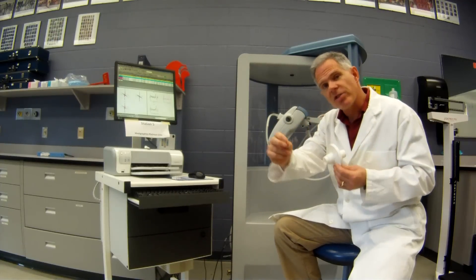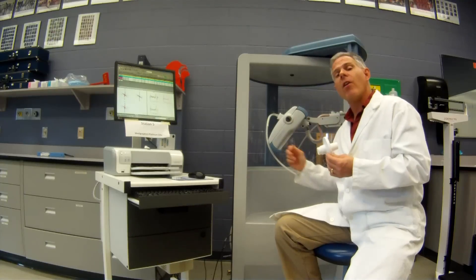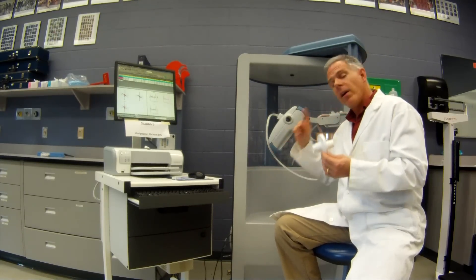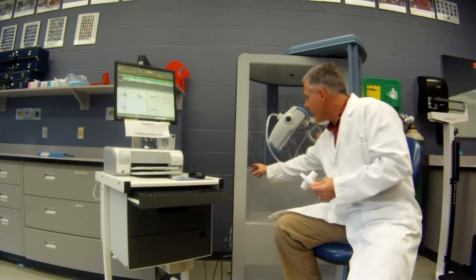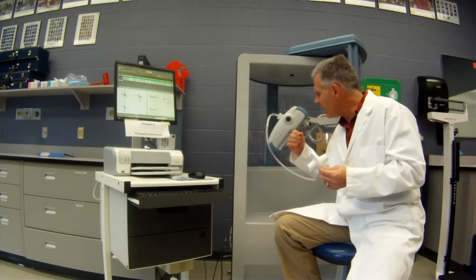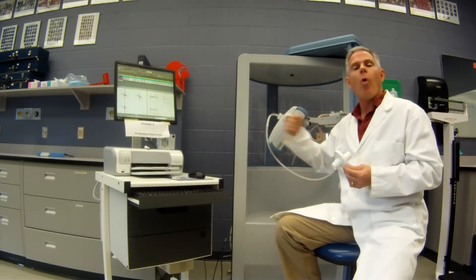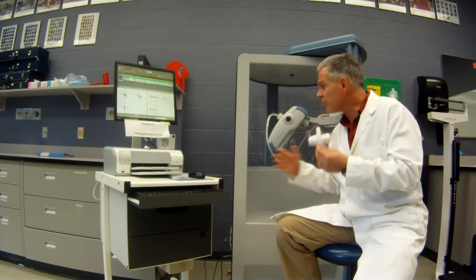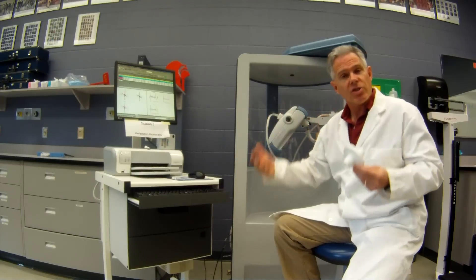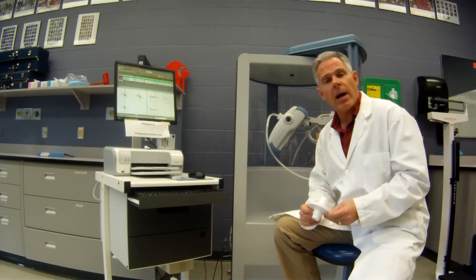That's part of your instructions - to get good, clear, precise instructions so that they can follow you. They can hear through there; we have a little speaker system as well. Always mention to your patients that they have an emergency release. If they're feeling a little claustrophobic at any time and want to stop the test, they can just slide the door open or hit the release and the door will open automatically. No reason to stress our patients out about this test - we can relax and do it multiple times if needed.